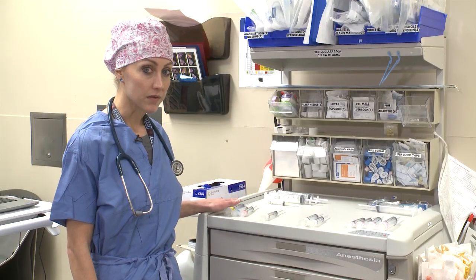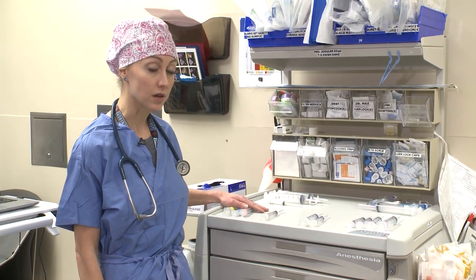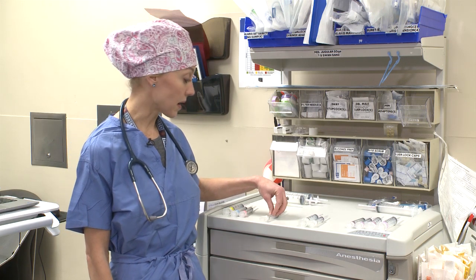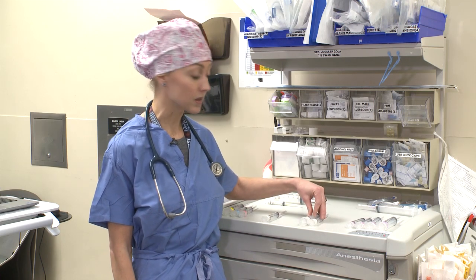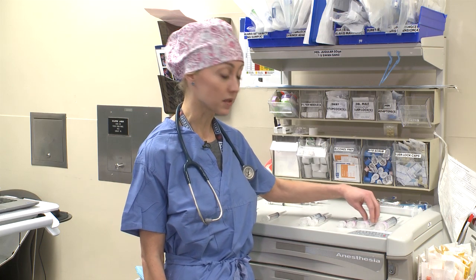Next, on your back table you'll have your drugs. You will have standard induction drugs — propofol, fentanyl, and your paralytics. Have a syringe for your antibiotics. Next you're going to have a variety of syringes both for uppers and downers. You have cardine and nitroglycerin, and next you have your epi, neo, and vaso syringes.